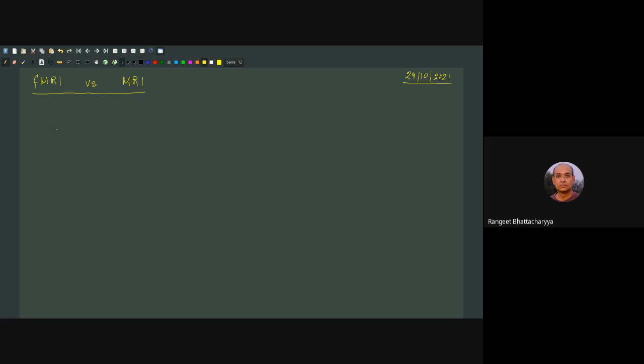Suppose you have some pockets of water and you are trying to find out where these pockets are. You record a spectrum and you find 2:1 intensity, and here too 2:1 intensity, and then you also record along this direction and you find 1:1:1 intensity.